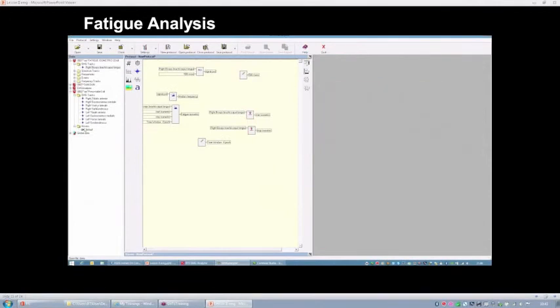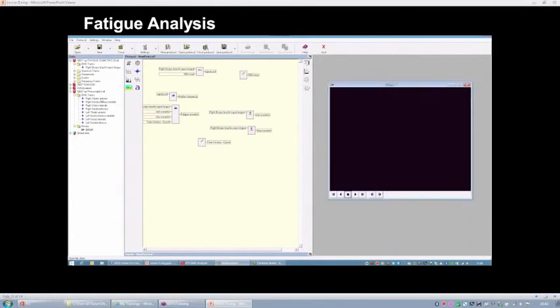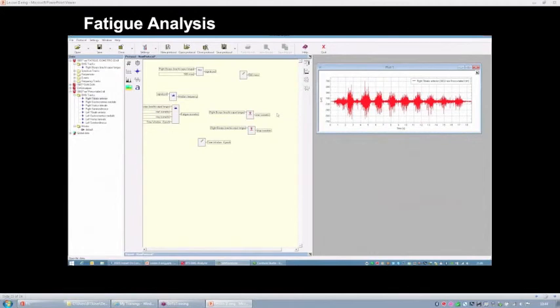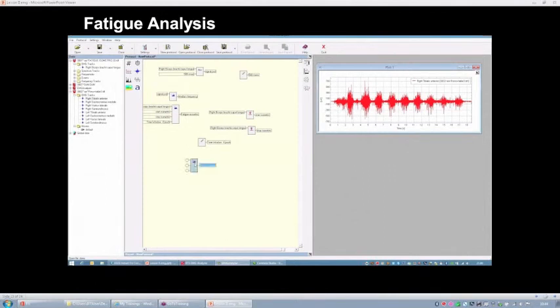Now I want to show you another example, where you don't want to investigate fatigue during an isometric contraction, but during a repetition of contractions. I'm sorry, I think that maybe you cannot see the video. In this case, you have two other blocks that can be used to investigate fatigue within the EMG analyzer application. I'm going to use this. With this block, the first input has to be the raw signal, and the other two inputs have to be events.